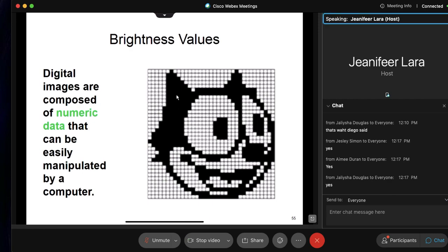Isbevi, what brightness level is this that I'm pointing at? It's high because it penetrated. So, okay, penetration, but I'm talking brightness level. So remember, is this high brightness or low brightness? Low brightness. It was a high value, right? Yeah. It was a high value. More energy was deposited here because the appearance gives us low brightness. A lot of energy was deposited here.